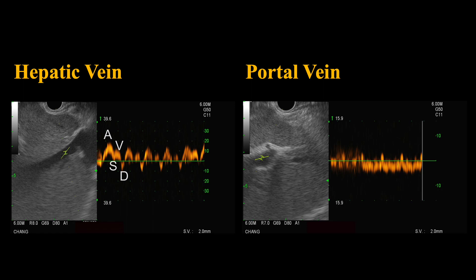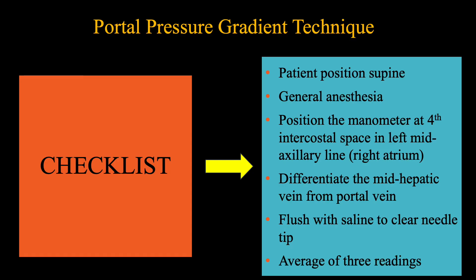The mid-hepatic vein has a thin wall with a four-phased pulse wave pattern, versus a thick hyperechoic margin with uniform venous hum of the portal vein. After the vessel is punctured, one milliliter of heparinized saline is flushed, and once air bubbles are visualized at EUS, the pressure readings are obtained. The average of three readings in the mid-hepatic vein and left portal vein are obtained, and the difference will be the portal pressure gradient. A value of five is the cutoff to determine the presence of portal hypertension.